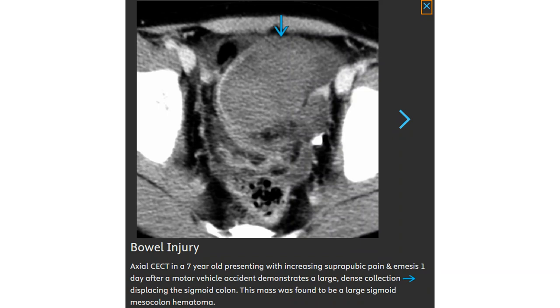Contrast-enhanced CT in a 7-year-old presenting with increasing suprapubic pain and emesis the first day after a motor vehicle accident demonstrated a large fluid collection displacing the sigmoid colon. This was found to be a large sigmoid mesocolon hematoma.